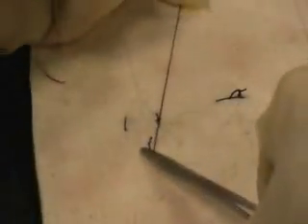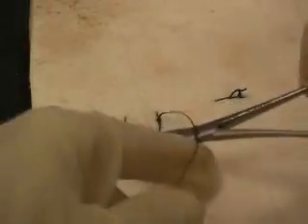There's 1, and we'll do a few more of these same steps for the instrument tie. And the last one. Okay, and then we're ready to cut.